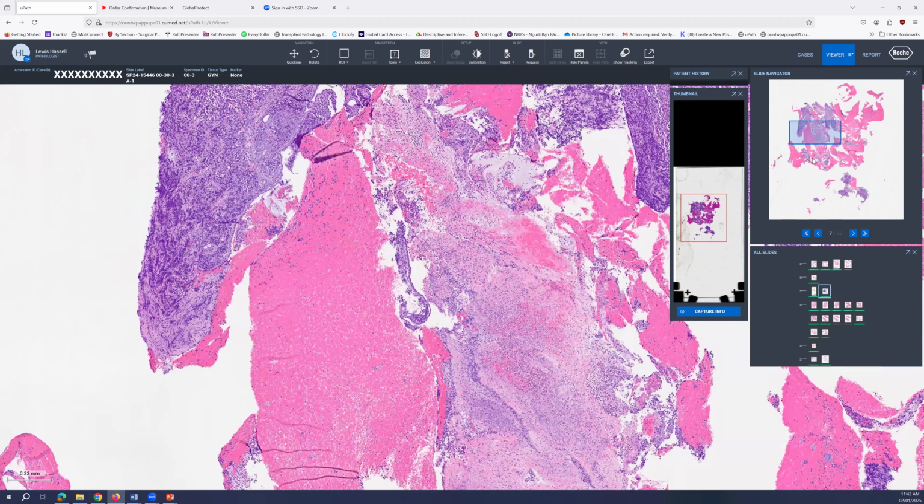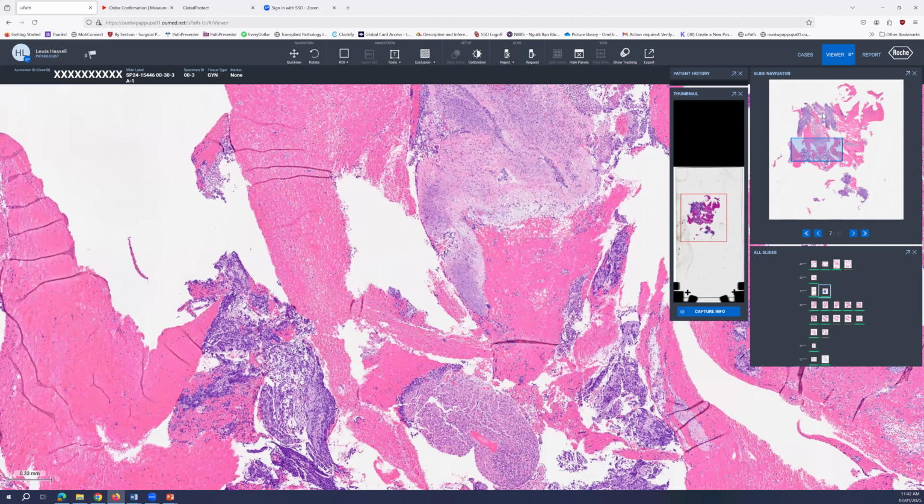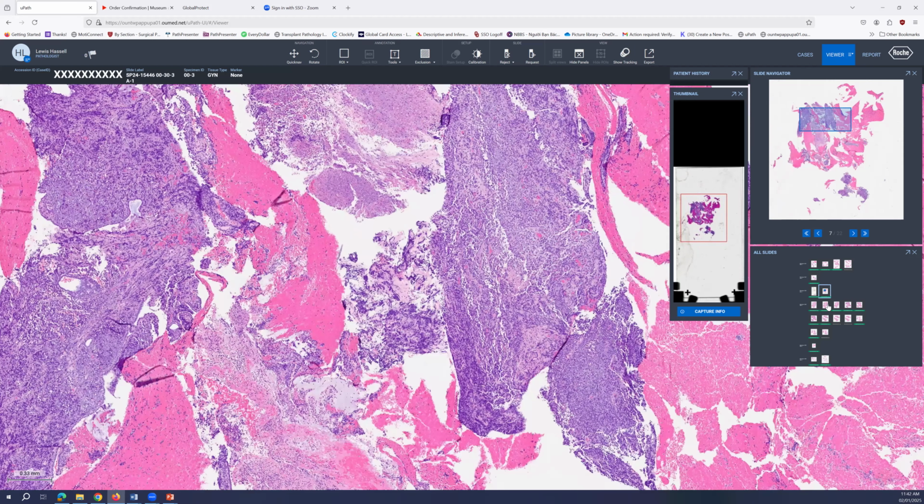So then I'm thinking, well, okay, maybe this is an undifferentiated neoplasm. Maybe it's metastatic disease. Certainly this pattern could be anything as well, including lymphoma, melanoma, and so forth. Well, let's go on to the next sample, which was from the endometrium.